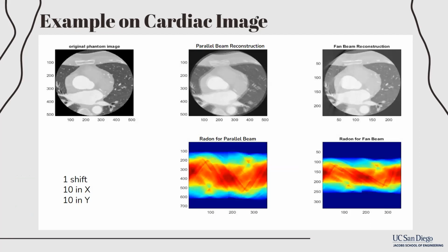So here's an interesting thing we wanted to look at, using the part data that was given in class, the example coronary patient. If this image was moved slightly, you can see the clear effects of motion on CT imaging, with blurring and streaking occurring in these 2 images, causing a lot of the structures to be significantly less clear and harder to interpret, which relates to many of the clinical effects we have been discussing.